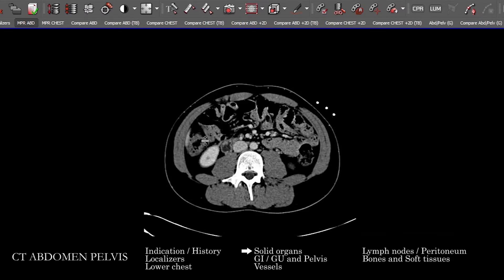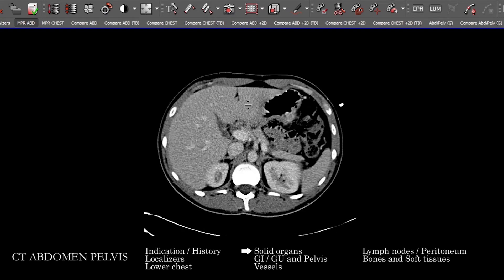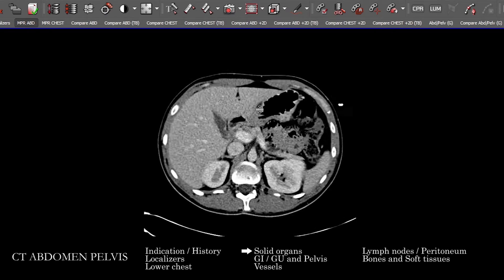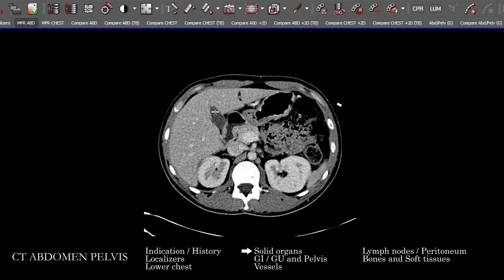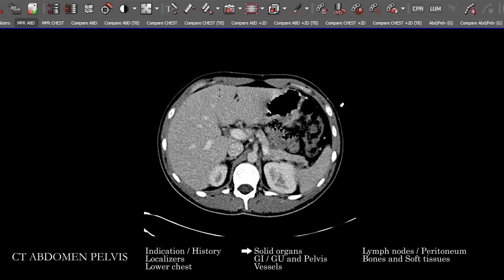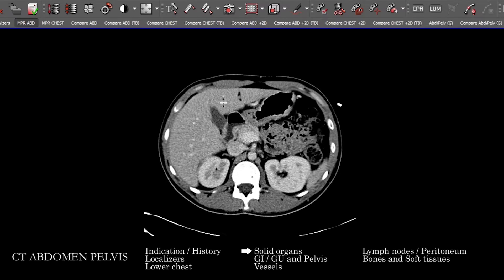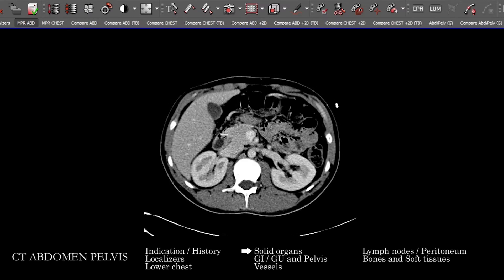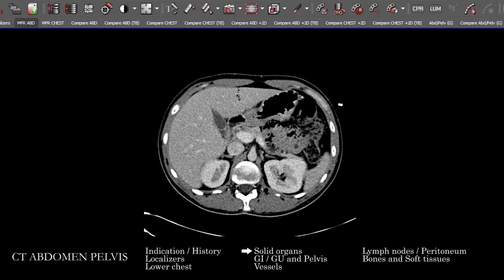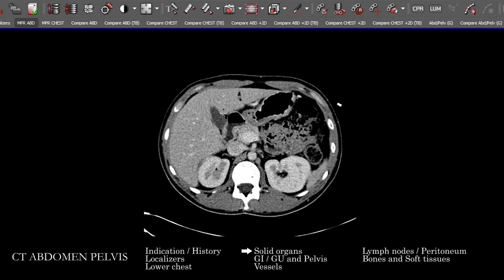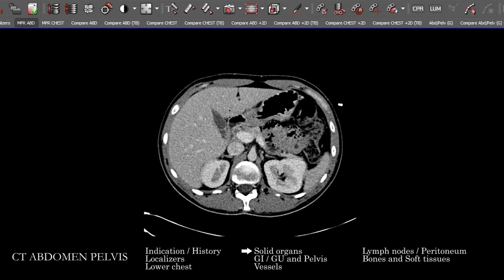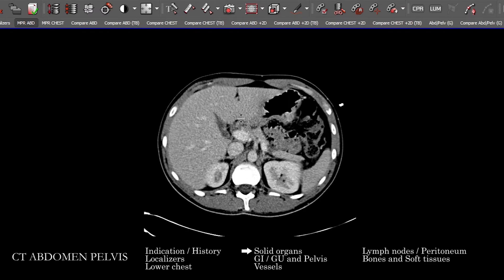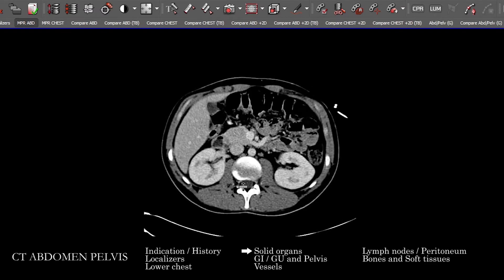We're going to take a look at the liver all the way down to its most inferior aspect, looking for any intraparenchymal abnormalities. Next is to look at the gallbladder and follow it out looking for stones, abnormal intraluminal abnormalities, sludge layering, wall thickening, pericholecystic fluid, and inflammatory changes surrounding the gallbladder fossa. We'll follow that down into the cystic duct and the region of the cystic duct.